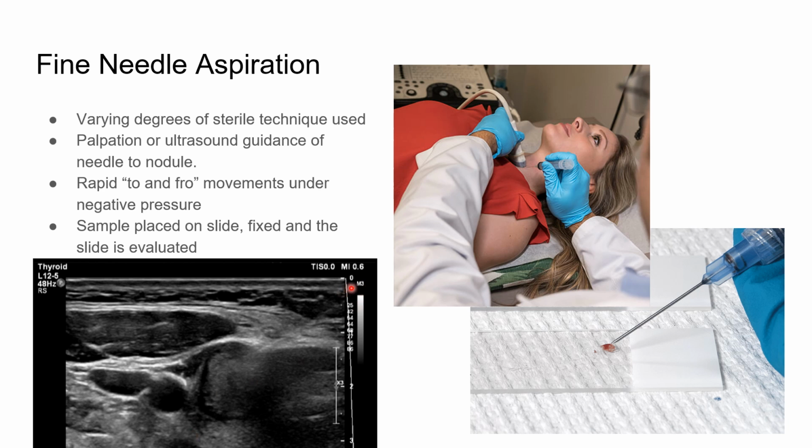If you look down here at this image, this is in the middle of a fine needle aspiration. This is that same mass that we had looked at previously. And if you can hallucinate this little kind of irregularity here, it's a little bit of a blur here. This is actually the needle coming in, just like you see up here, parallel to the probe. And because it's parallel, you can see the whole length of the needle.